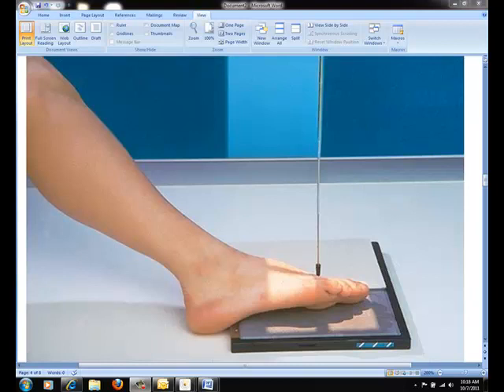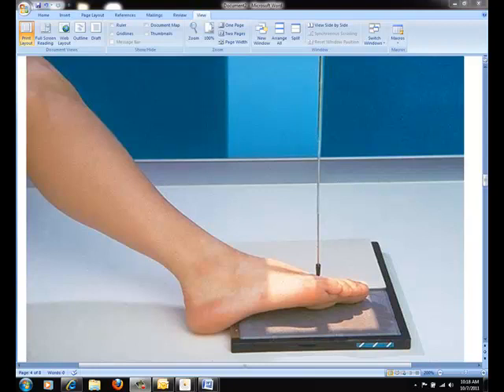Once an AP projection is performed, you are ready to move the patient into an AP oblique projection with medial rotation. For this, simply medially rotate the lower leg and foot, adjusting the plantar surface of the foot to form a 30 to 45 degree angle from the plane of the IR. Once again, the central ray is the same perpendicular and entering at the third metatarsal phalangeal joint.